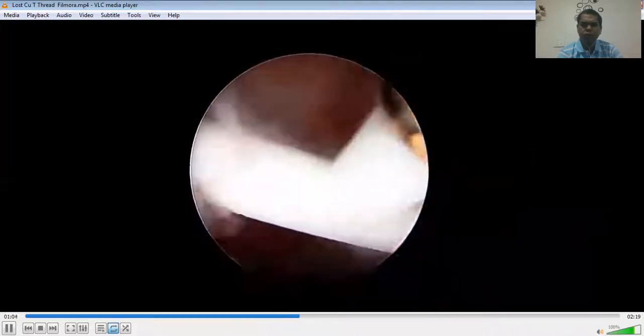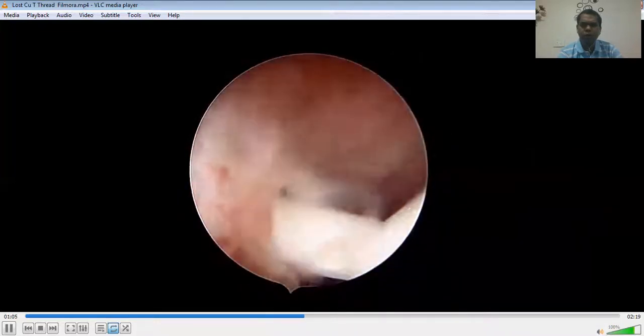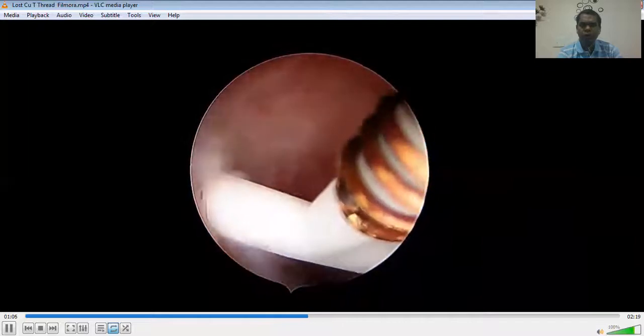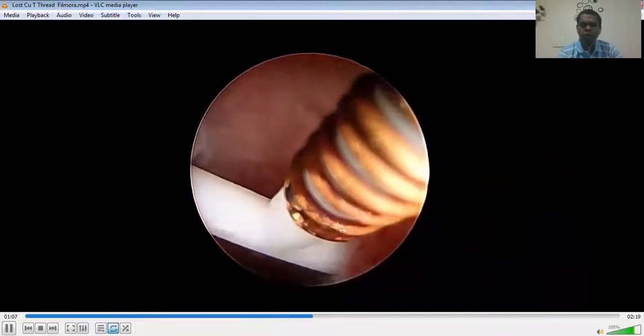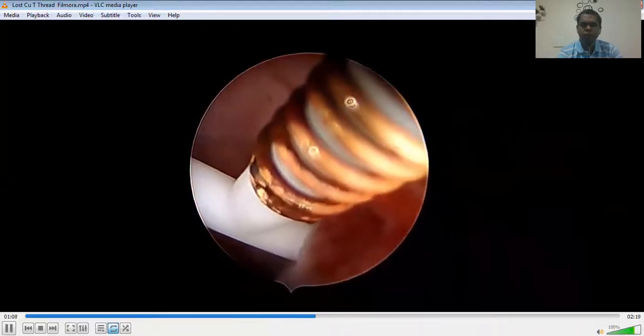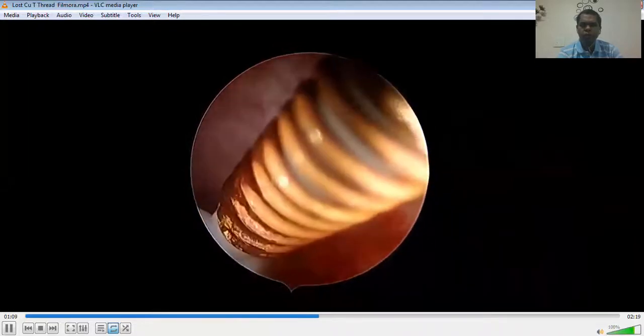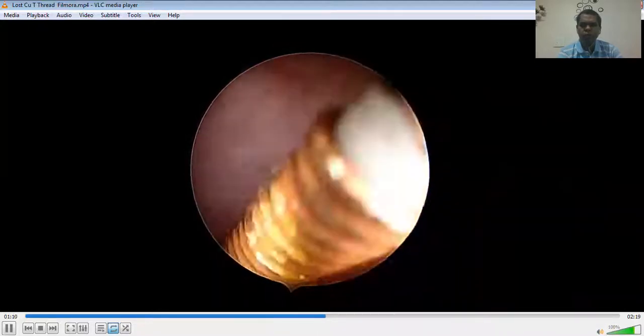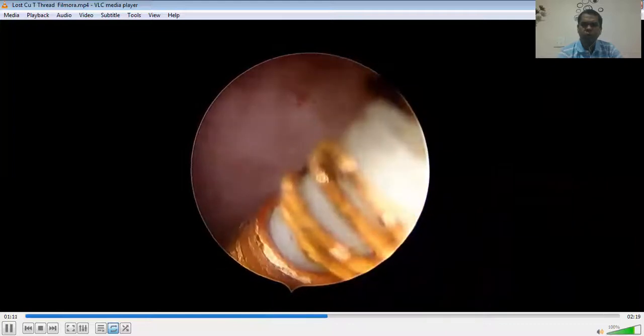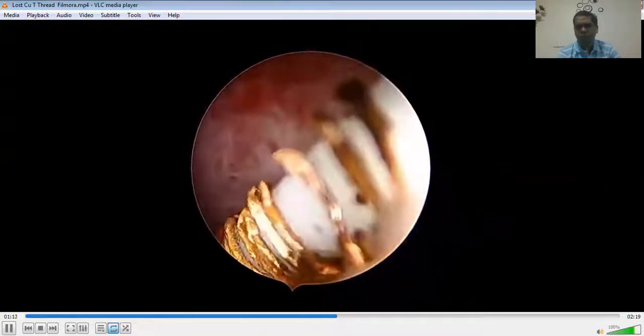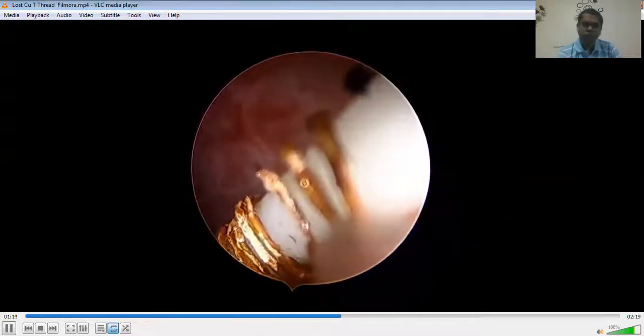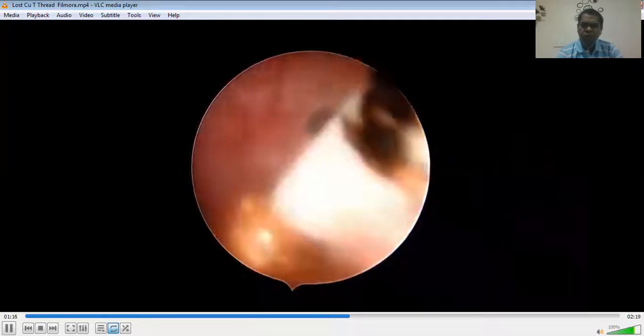Now this is the copper T. One can notice the broken copper T fragments.